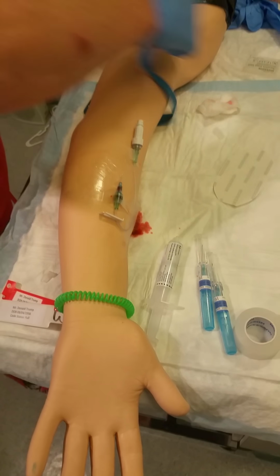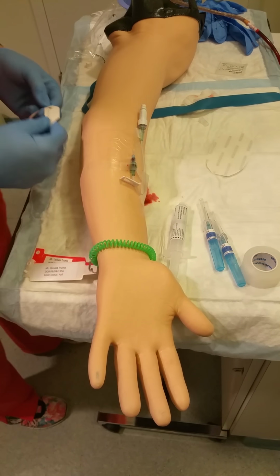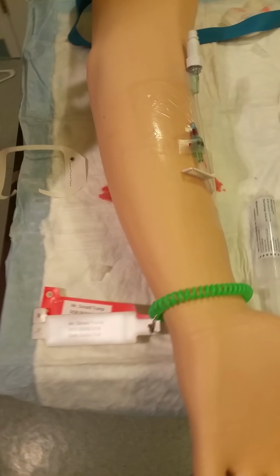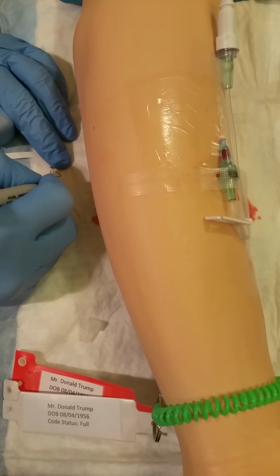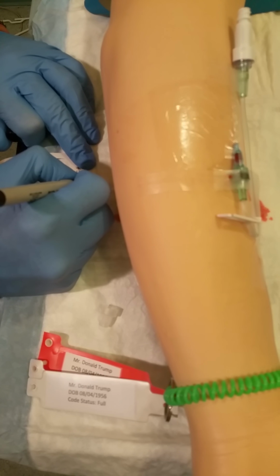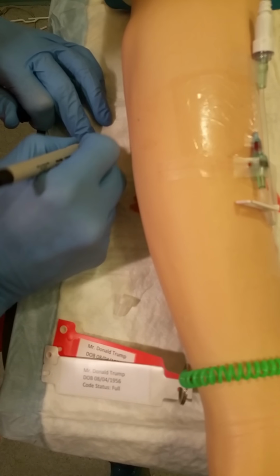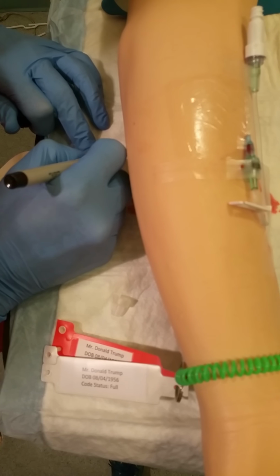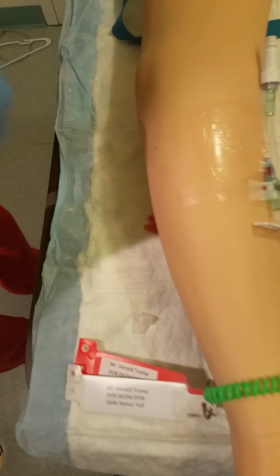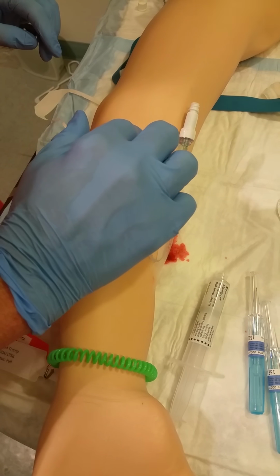So the tourniquet will come off. I'll prepare a label for this IV site. The label will include date and time. It's about 1340. My initials, and the gauge of the catheter. It's a 22. The label goes adjacent to the tegaderm so that we can visualize our site.